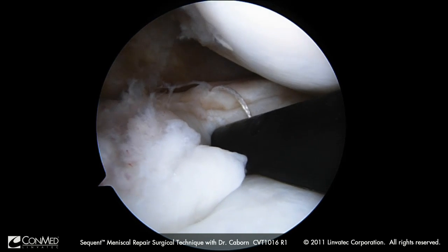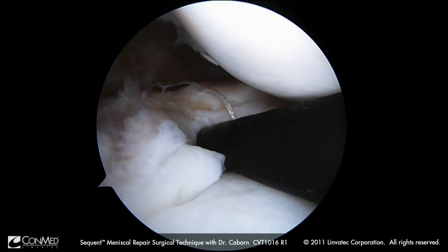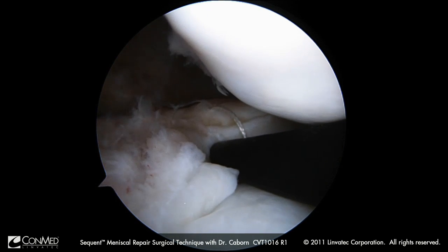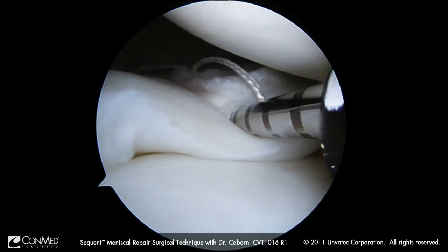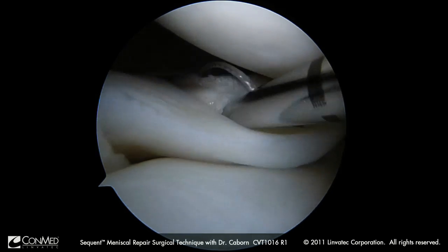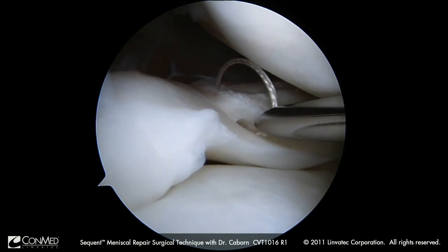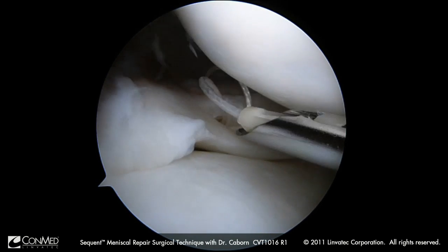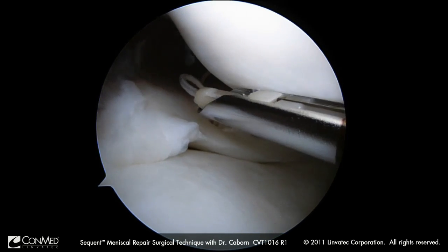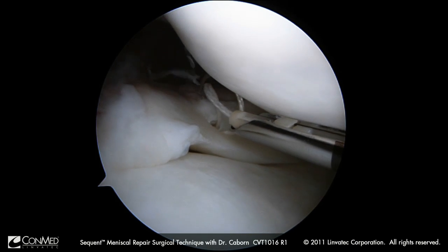Take off the safety on our trigger, click it forward — you heard the click. Then I am going to pull this back to deploy my implant, so I just slightly turn this down as I come out — it is a gentle move. Now we see our looped suture. I am coming back, red button on, so now I have taken it out of freewheel mode and I have got tension in the system.